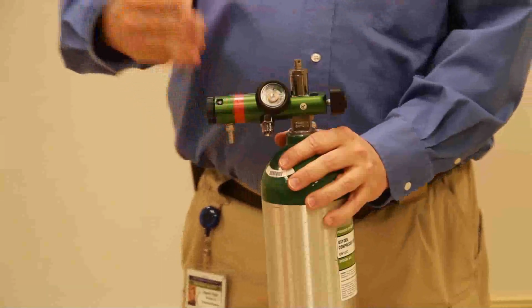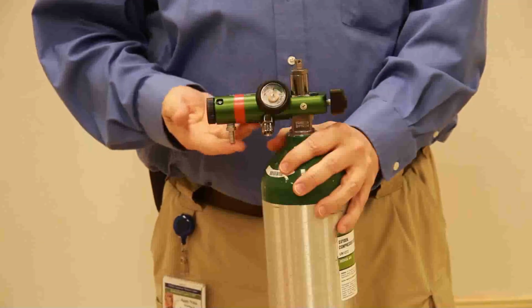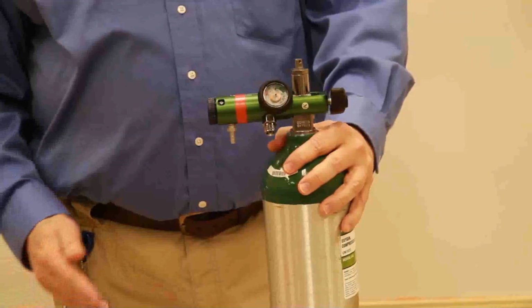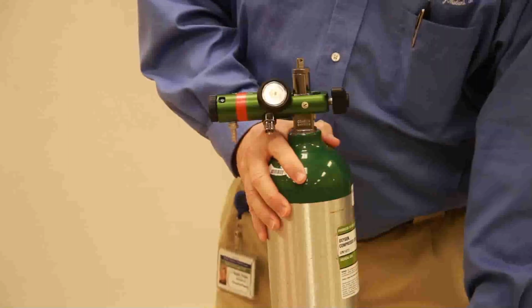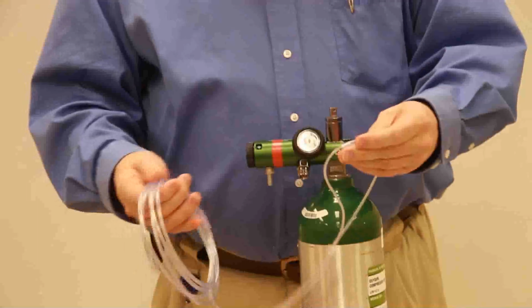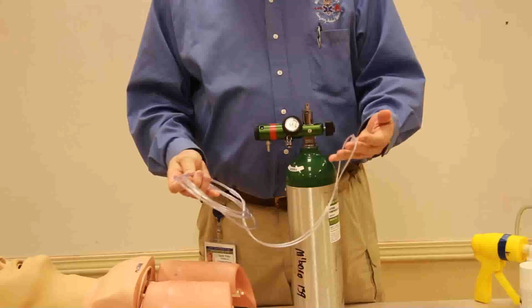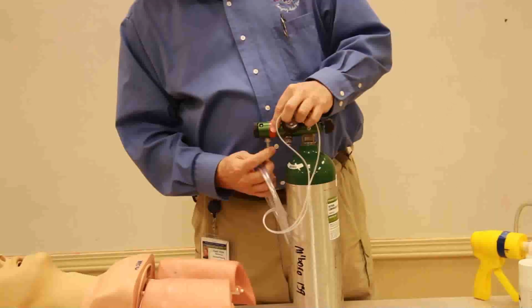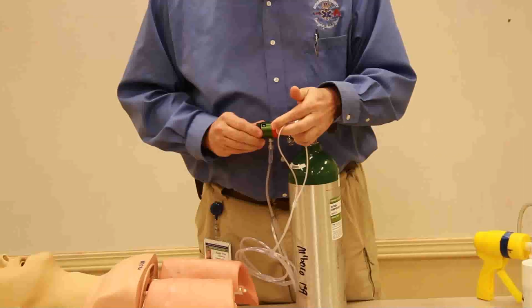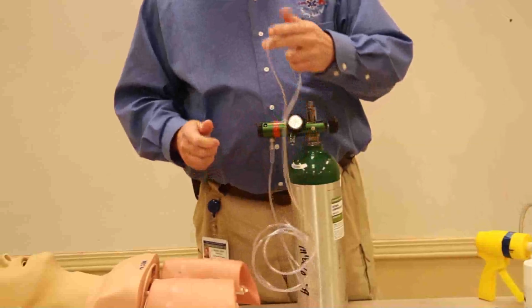So now I have my oxygen tank set up, it's there. Now how do I get oxygen from the oxygen tank and the oxygen regulator to my patient? The first device I'm going to talk to you about is the nasal cannula. The nasal cannula gives somewhere around, when we're at 6 liters, somewhere around 44% or so, okay? And so we are going to just attach the nasal cannula. We're going to make sure that our oxygen is on, and I'm going to set it to 3 liters.